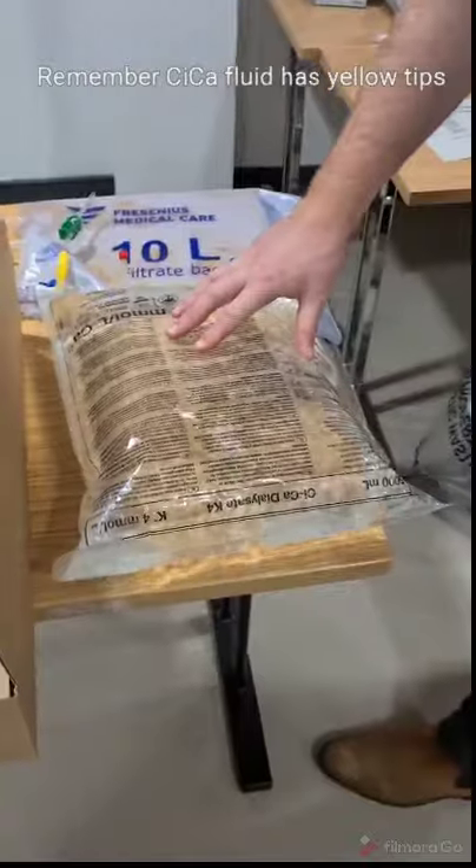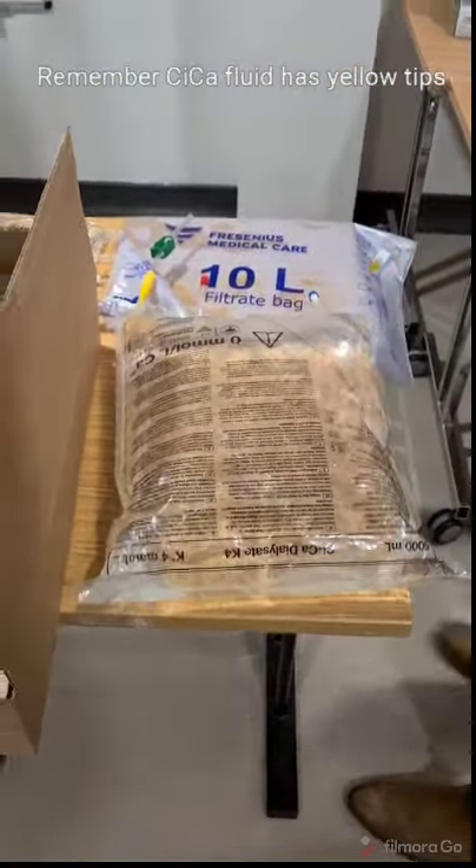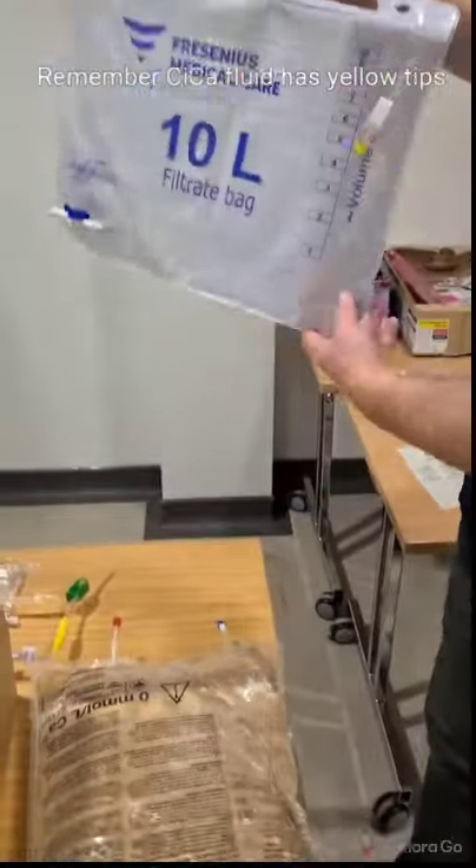We have our Dynaset bags here. We're using four bags, but for today's session we're using one at the moment. We have our filtrate bag, or our effluent bag.